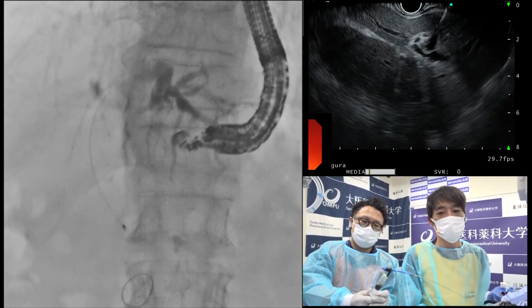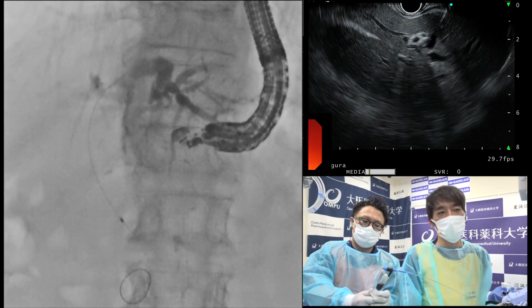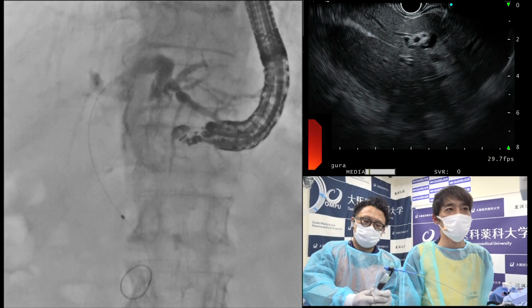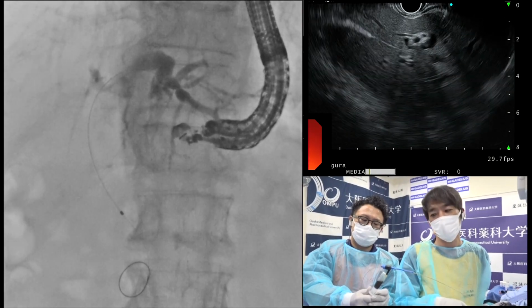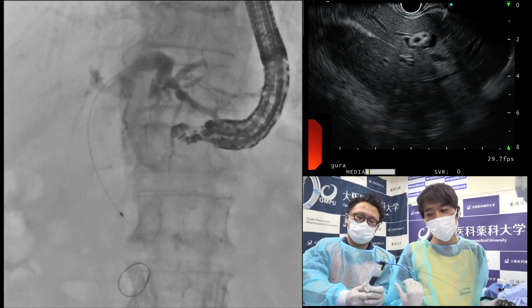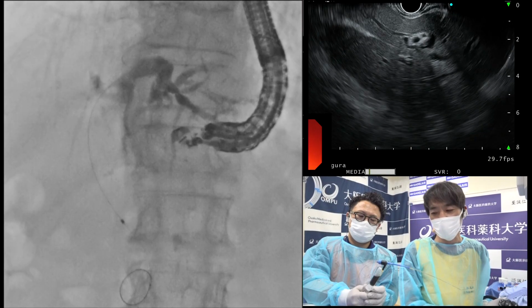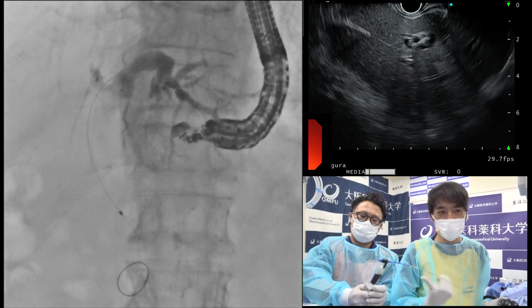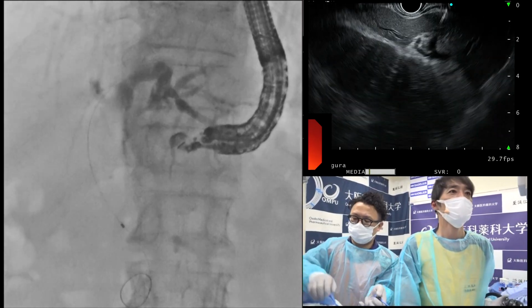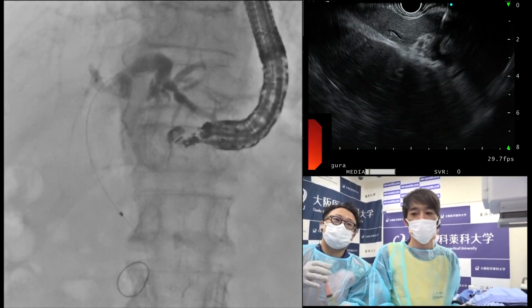Is that for further cytology? What do you need it for? To prevent cholangitis after contrast medium injection. Usually 20 ml is aspirated, and 10 ml of contrast medium is injected. Okay. Next we insert the contrast medium.